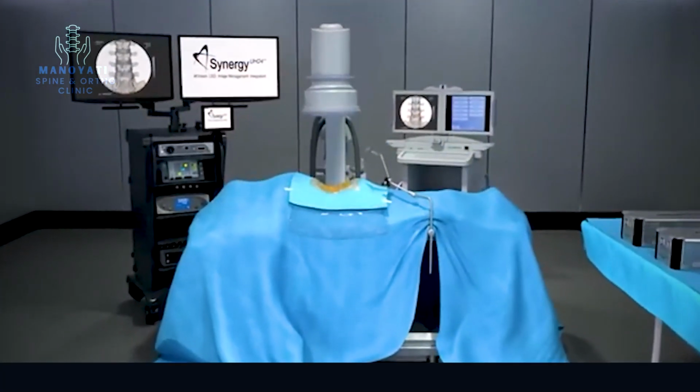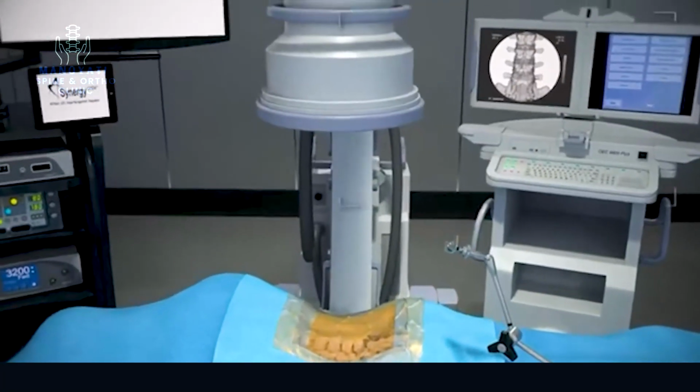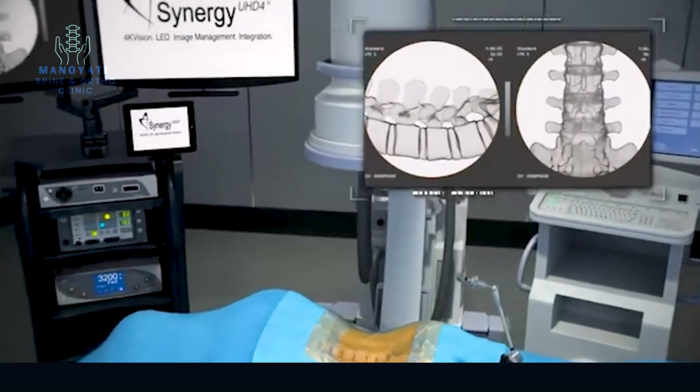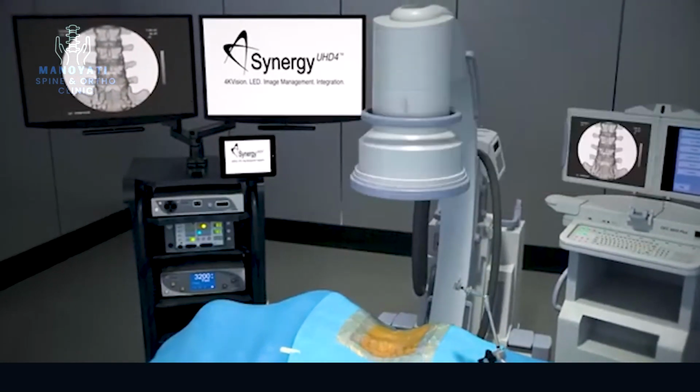Place the patient in the prone position and use a C-arm to verify the correct level being treated, using both AP and lateral images based on the preoperative MRI. Use a 6-step approach to complete the procedure.